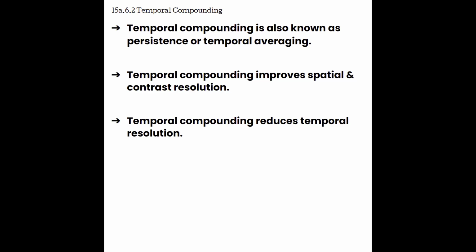And to improve the image then, it layers those same angled images upon one another to create a higher quality picture. But it still requires the frames to be created and then averaged together. So essentially, again, we are creating one frame from many pulses because we need more frames to create it, and therefore temporal compounding can reduce your temporal resolution.